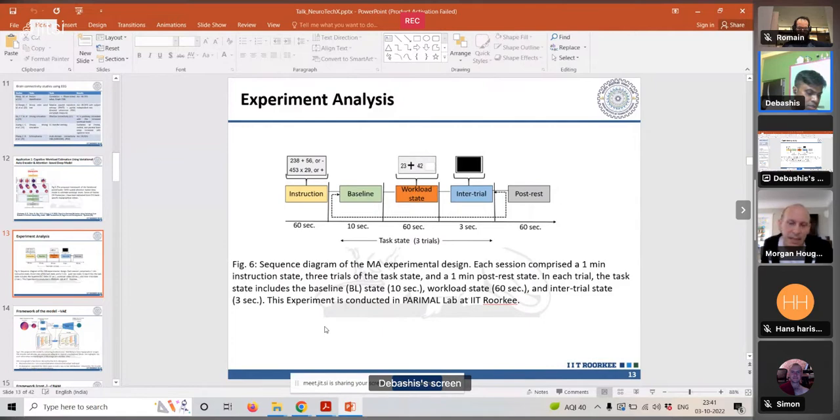And with 32 channel data, you know it's going to be aliased, right? Like you said, I think Scott Makeig's results, finding single dipole generators with ICA, came from maybe 64 channel data, but maybe 32. But without dense sampling you can get spatial aliasing, because you don't have the coverage to capture the spatial dynamics, and across subjects that's just not very reliable.